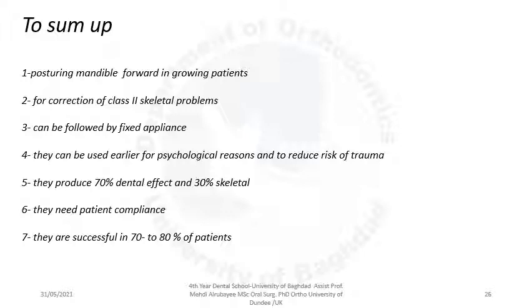Fifth, they produce 70% dental effect and 30% skeletal effect. Sixth, they need patient compliance. And seventh, they are successful in 70 to 80% of patients.